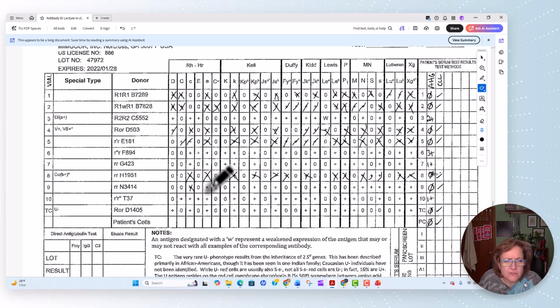I once had a student who, after coming to clinical, came to me and said, "Oh my gosh, this is how they actually do it in the lab." Yes, this is really how they do it in the lab. It's very manual. There is no good method to do it. If you're in a blood bank that does this testing, this is how you are going to do it. It was kind of funny. They were really surprised that there wasn't a more instrumented way of doing it.